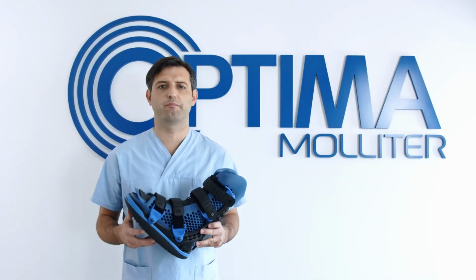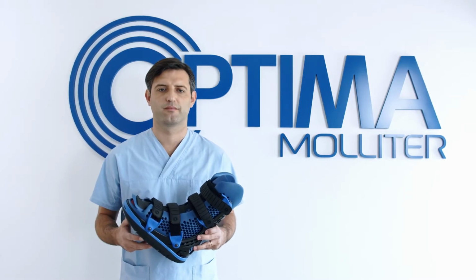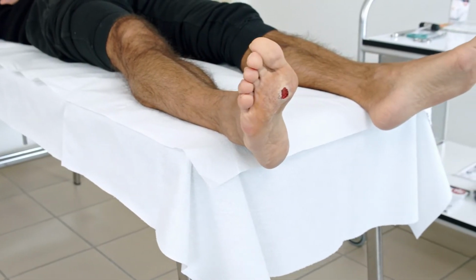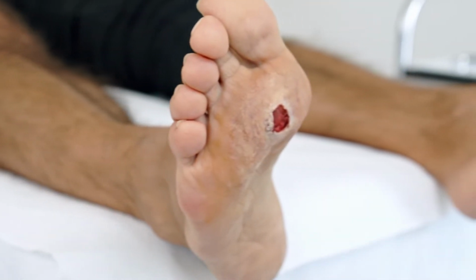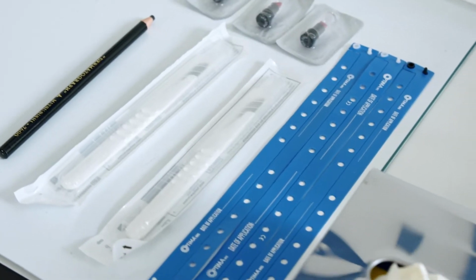In this video we will show you how to apply and adapt the SBI Walker device to the patient. In the first of our two cases, we are dealing with a patient with an ulcerated plantar lesion in the area of the second metatarsal head. It is a neuropathic lesion, therefore reducing pressure is the primary goal.